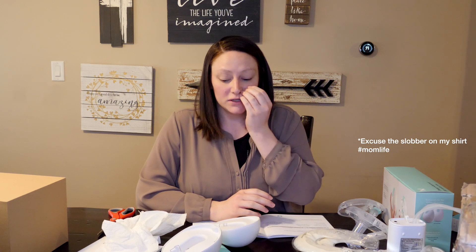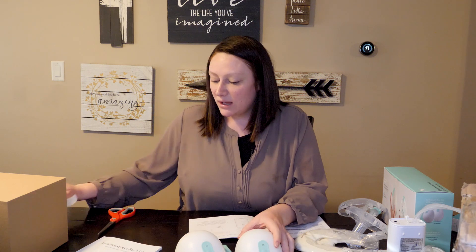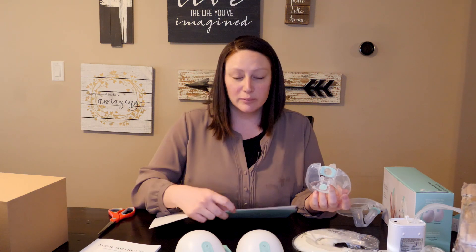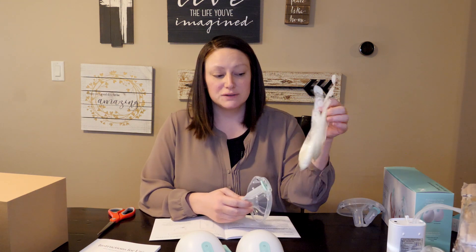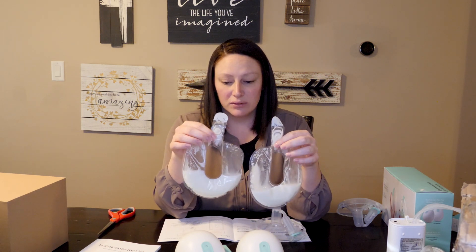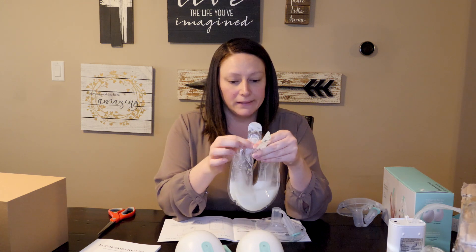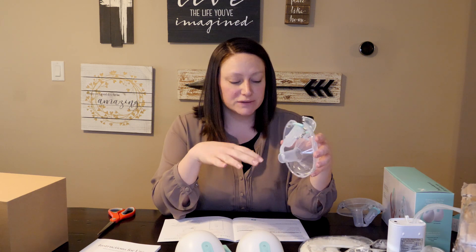Okay, so first impressions of the Willow pump — I've got kind of a mess in front of me, but it was pretty easy to use. The instructions and app and the little get-started book were pretty easy to follow. I just used the bags this time and was able to get a little over two ounces and then around four ounces in each bag. It was pretty easy to put together. Whenever I do my full review, I'll go through the milk containers.